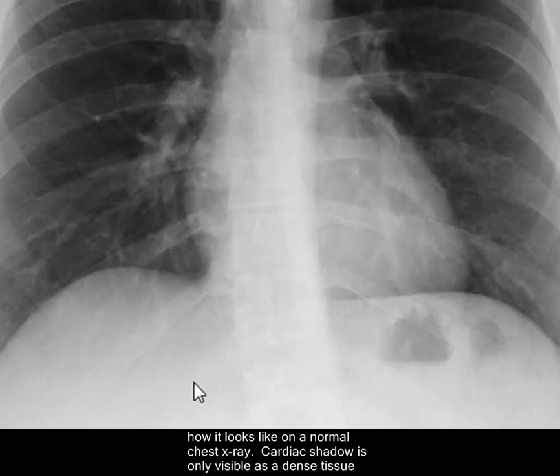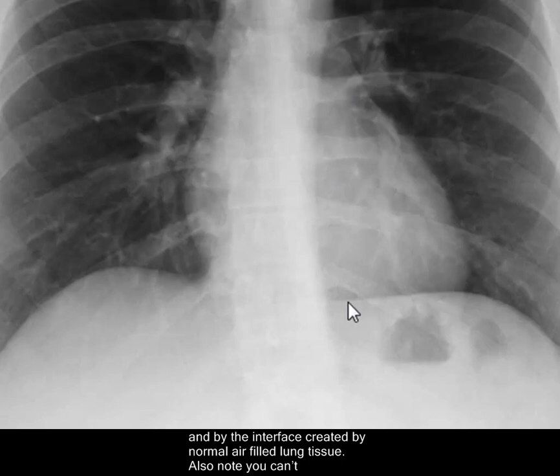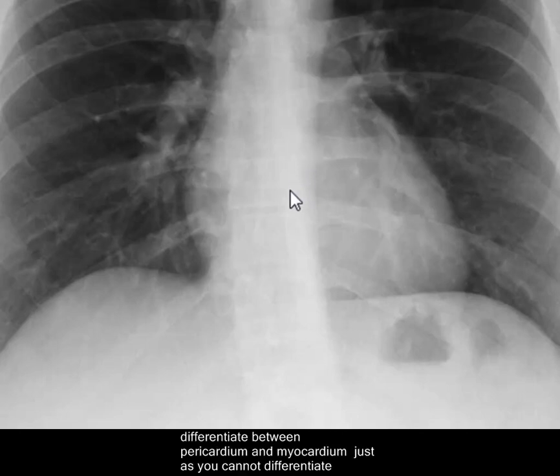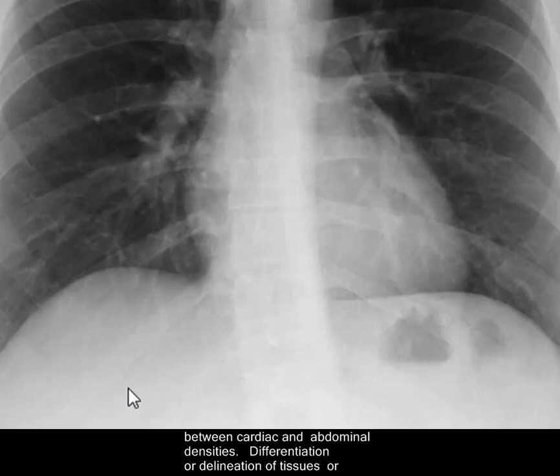The cardiac shadow is only visible as a dense tissue by the interface created by the air in lung tissue. Also note that you cannot differentiate between pericardium and myocardium, just as you cannot differentiate between cardiac and abdominal densities.